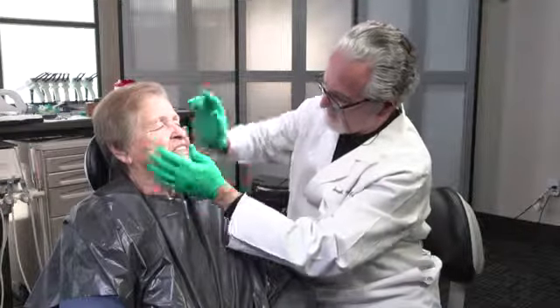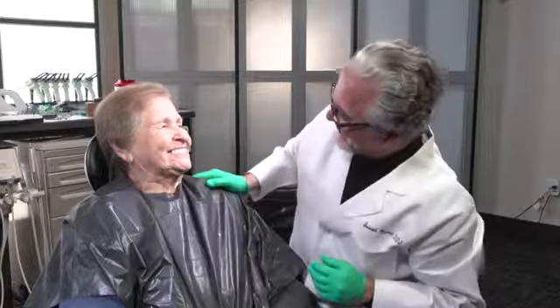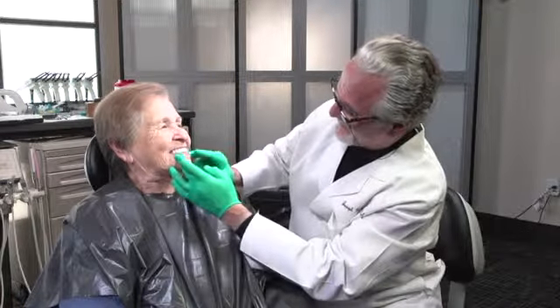Insert the denture with the shells in place and evaluate midline, high lip line, low lip line, labial lingual position, and facial harmony. Make sure that the canines are appropriately positioned to look natural in the mouth.